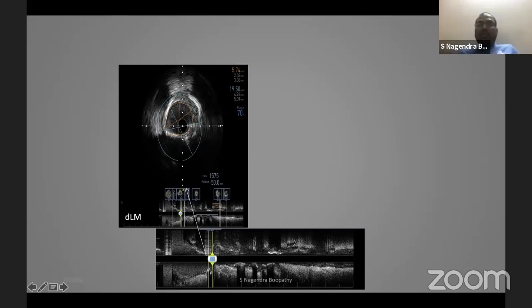Yes, sir. This blue line is only an approximate line, because the EEM diameter was the same in the proximal left main, so we put the same EEM diameter there. It is absolutely not right, but possibly the best way we can measure. Otherwise, we can't measure at all. There is no branch between the left main ostium and the distal left main, so we use the EEM where left main originates and the same circle, sir. It's only an approximation. We cannot do it otherwise.